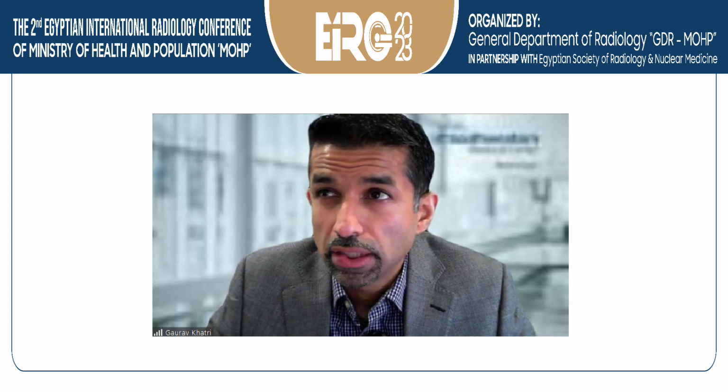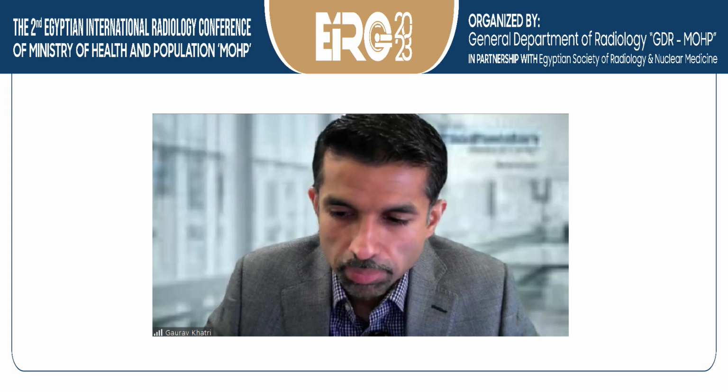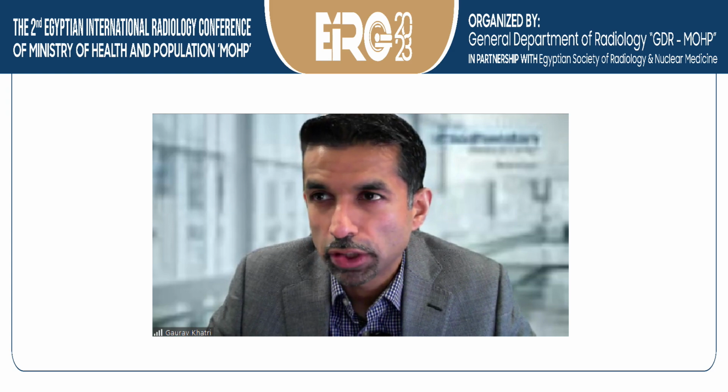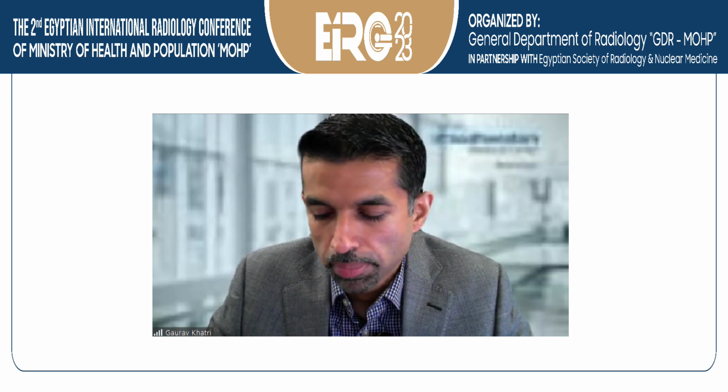Usually, one of our urologists orders a lot of these examinations. They usually, for slings, will start with ultrasound. And then if the ultrasound is not able to explain the clinical symptoms, they may get an MR later in a select group of patients. We don't do it together.